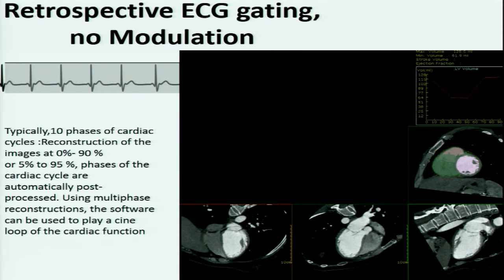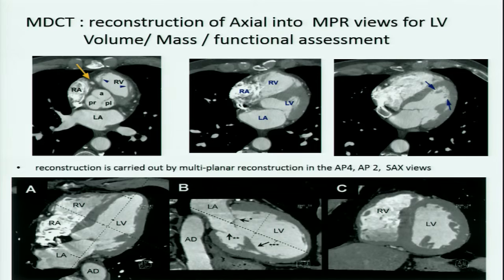But the main difference with CT compared to CMR is a true 3D acquisition. So you don't have to prescribe any specific axis. You can just acquire the 3D data set, and then afterward, do the processing. You can orient it, reconstruct to the axis you want. For instance, right here, the top portion is the actual image.